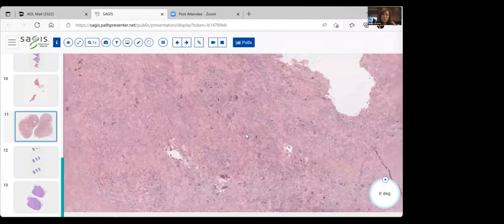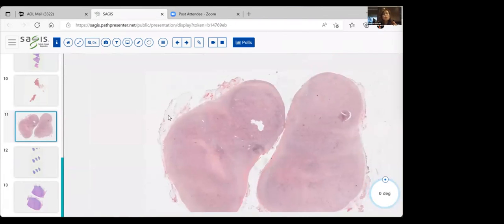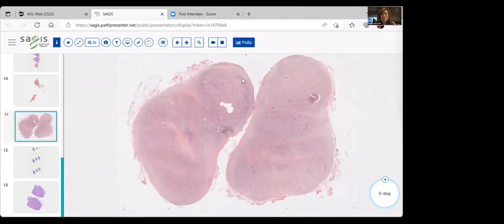And again, let me show you that they're very well-defined nodules. You can move them if you've ever seen one clinically. You can move them, and they're sometimes attached to the tendon, right? So you could possibly remove them yourself, or sometimes I have ortho remove them just because of the attachment, I don't want to get too deep and mess anything up, of course. But I think this is a great example.